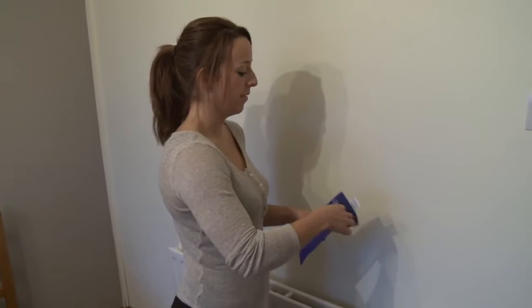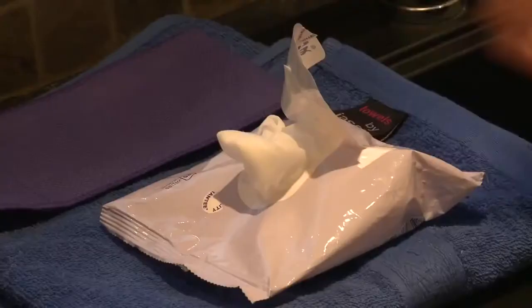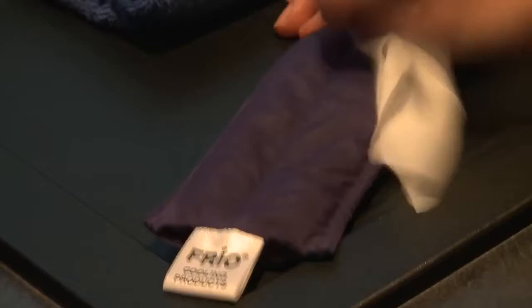When the Frio Wallet is not in use, remove the inner wallet from the outer cover and allow it to dry on a radiator or in an airing cupboard with just occasional turning. To freshen the Frio inner wallet, we recommend you use antibacterial wipes.